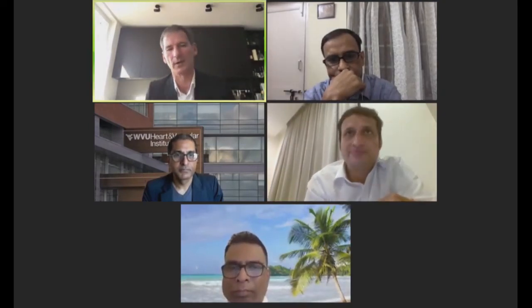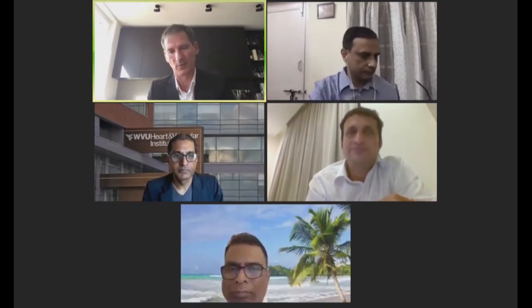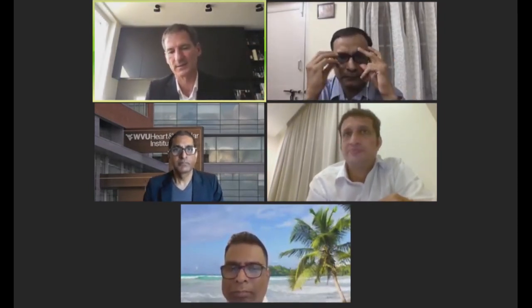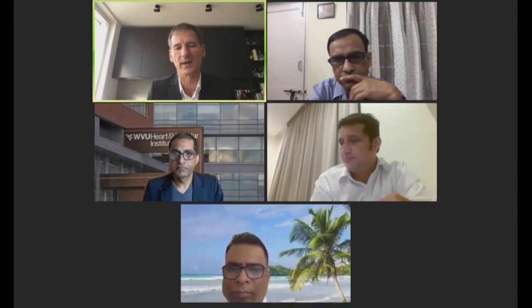Yeah. So two things to be considered. I would take the upper lobe all the time that is aligned with your sheath, not the lower one. And the oversizing is really forgivable with Lambre. The umbrella is really flexible.